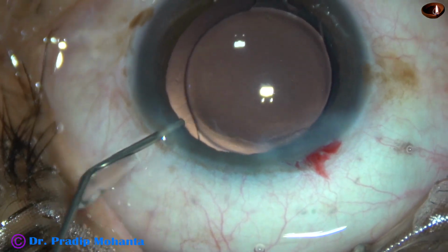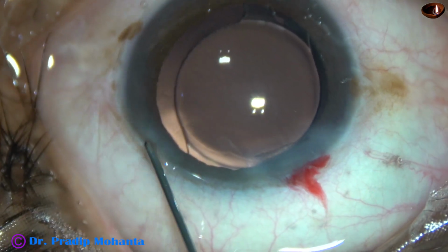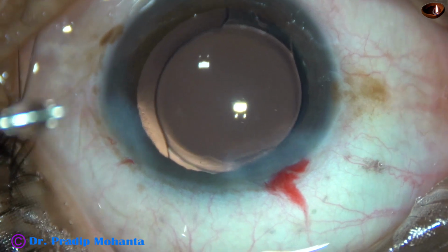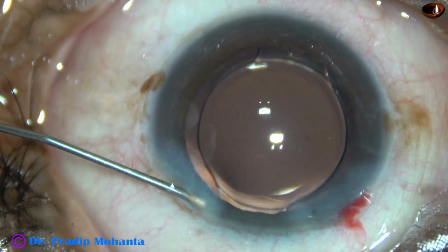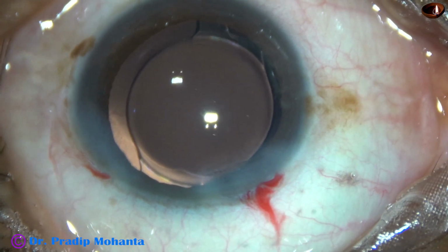Now this is a bit of moxifloxacin. Now in this case we did only one side port. Corneal stroma on either side of this stab incision is hydrated to close the side port.